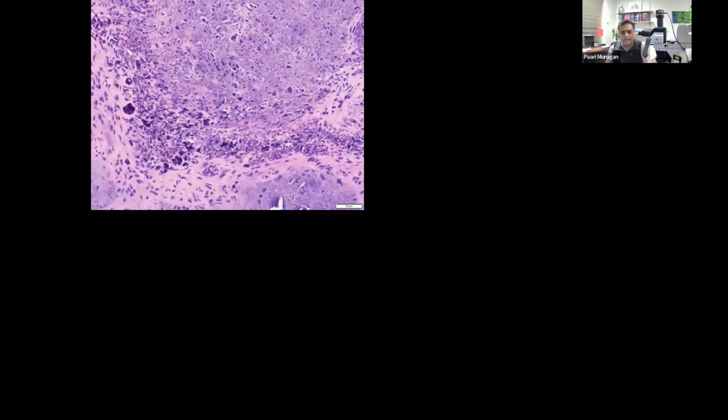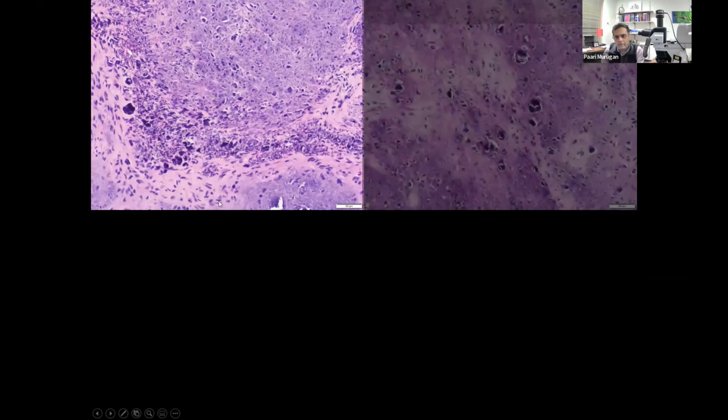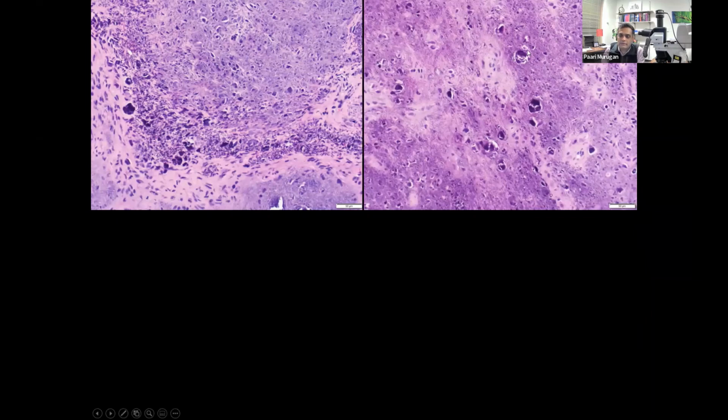And the calcification was much more prominently seen in the resected specimen. This classic dirty or grungy calcification was present in many areas. And in some zones, it also formed these peculiar floret or flower-like crystalline appearances.